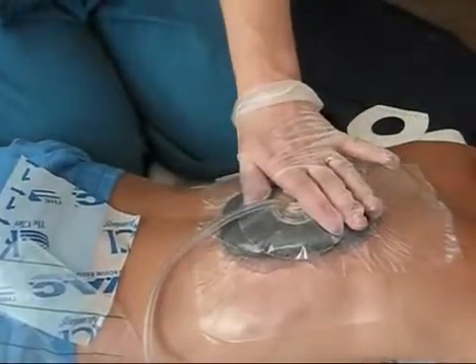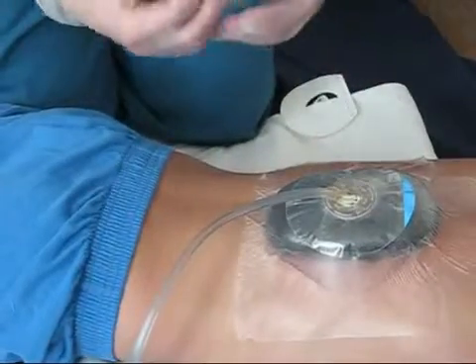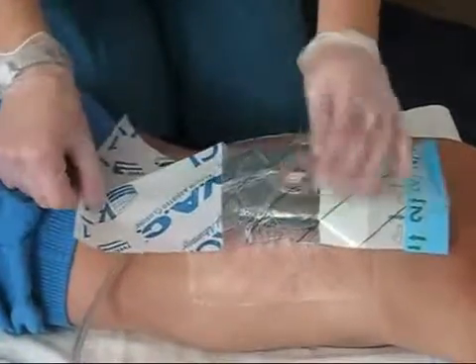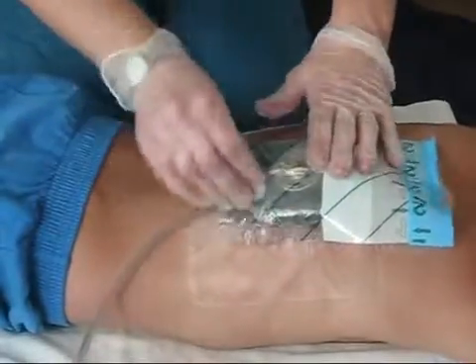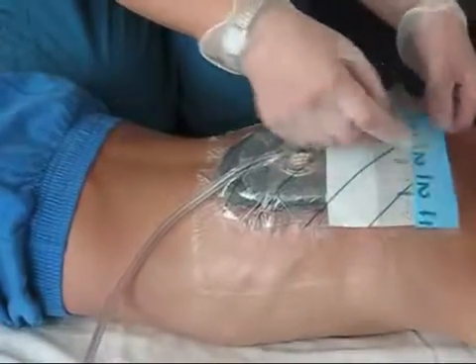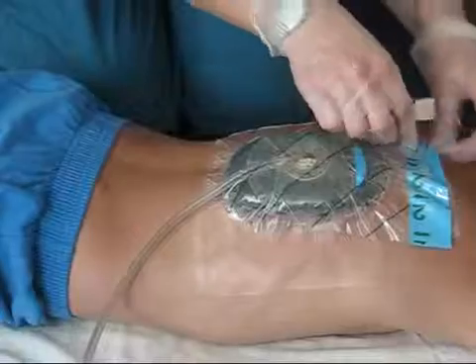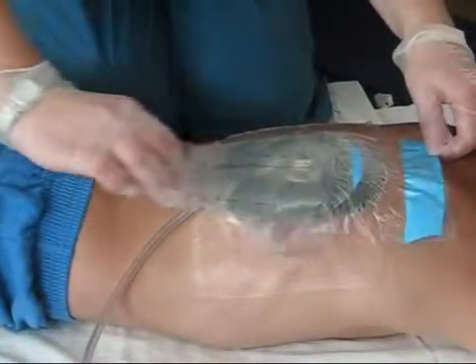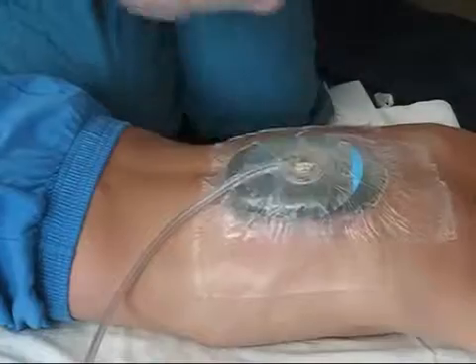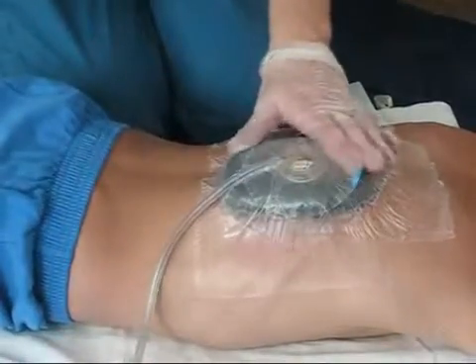Okay, then you'll want to take more drape and the suction tube. Then you're going to want to create a good seal over the suction tube. Then you will hook the end of the tube into the negative wound pressure system.